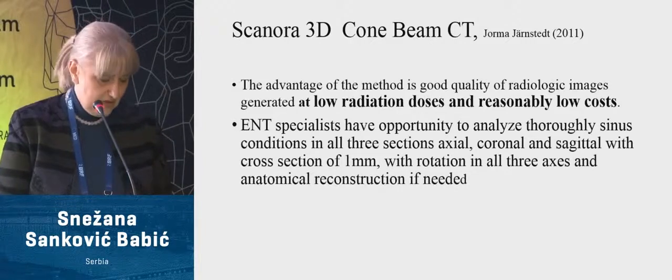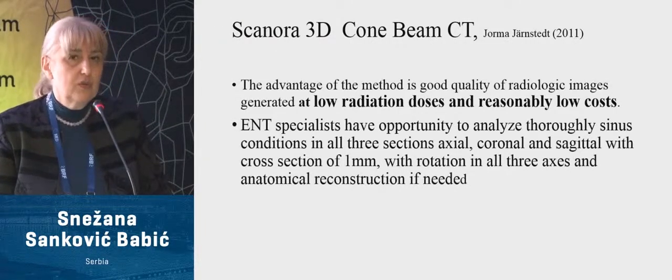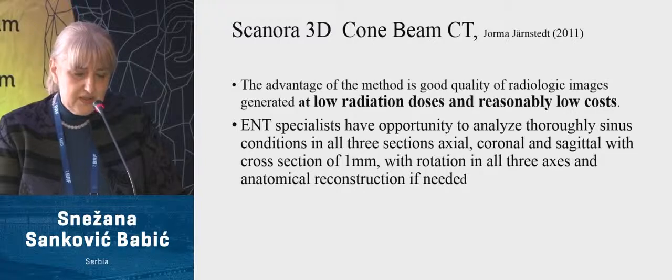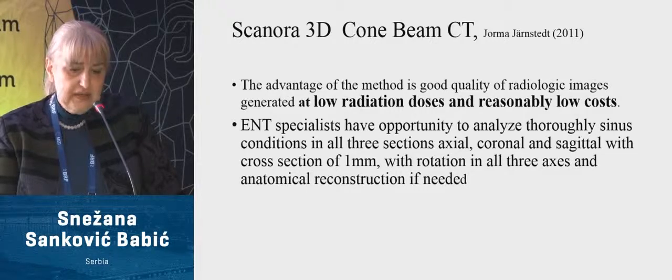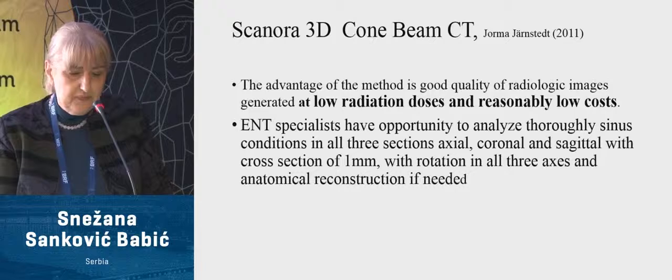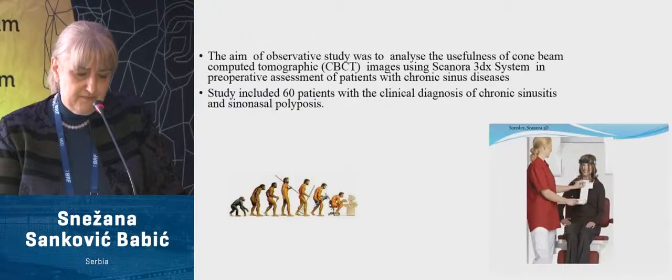What about Scanora 3D and ENT diseases? Finnish authors were the first to describe it clinically in a series of studies. What is the advantage of this method? The advantage is that the radiological images were of good quality. They were generated under low radiation doses at reasonably low costs.